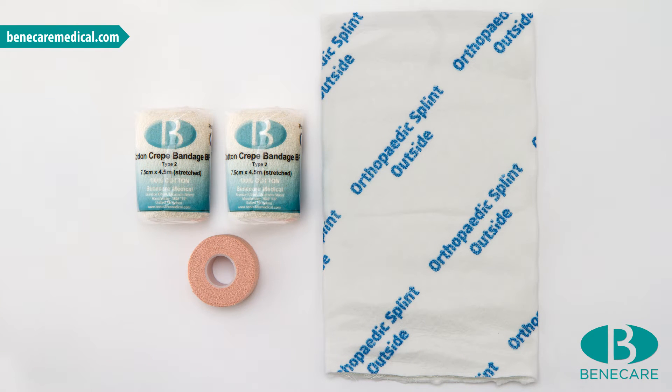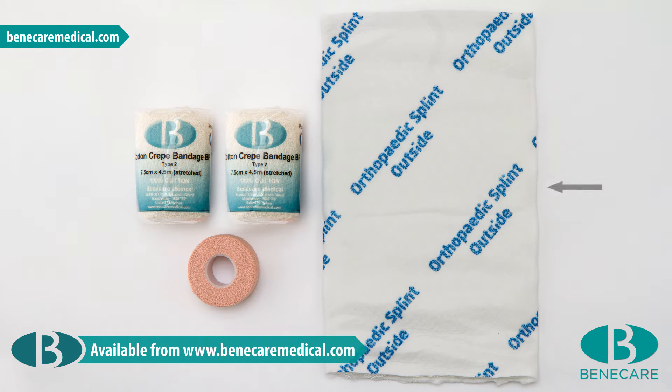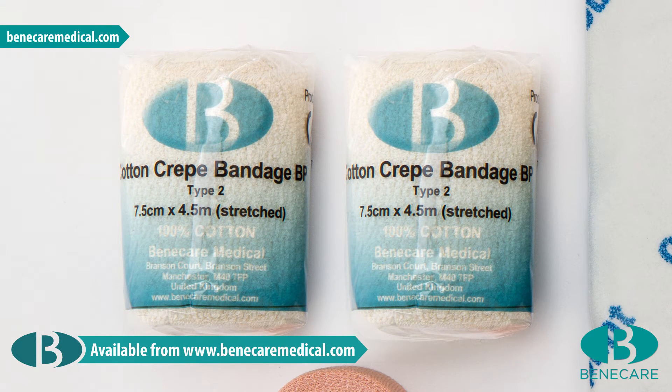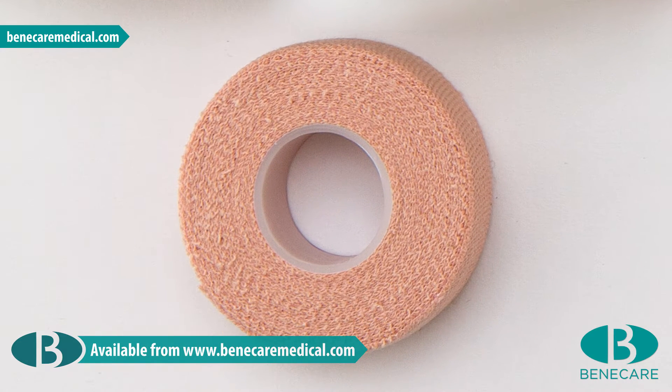The products required for this application are 1 box of Benicast splint on a roll 15 cm, 1 or 2 Benicast cotton crepe bandages 7.5 cm, and 2 small pieces of adhesive tape.